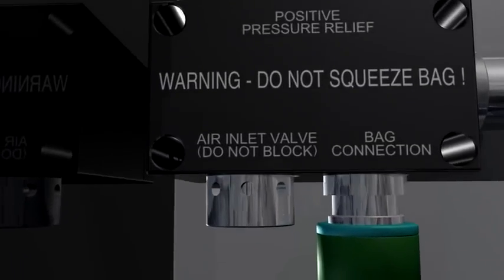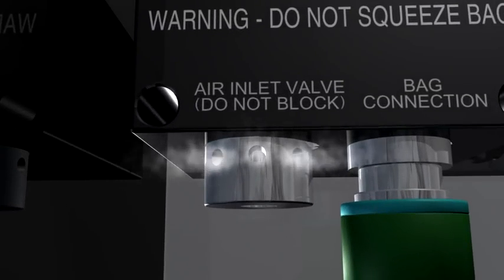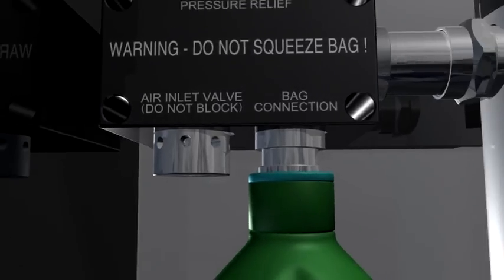Third, the air inlet valve allows room air to be drawn in whenever the supply of oxygen is less than the demand as expressed by the patient's minute volume. We'll come back to this shortly.